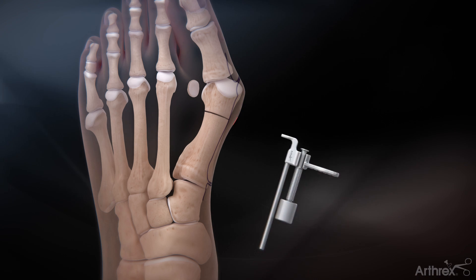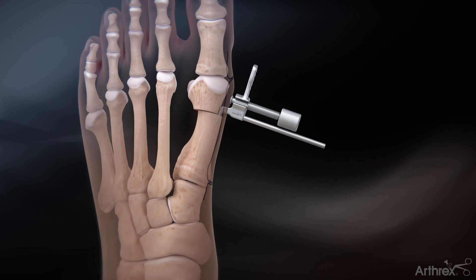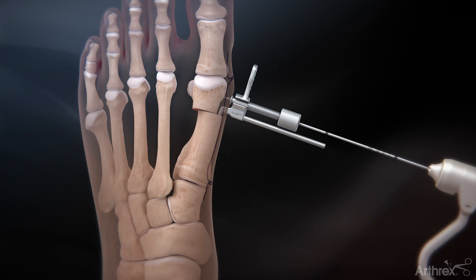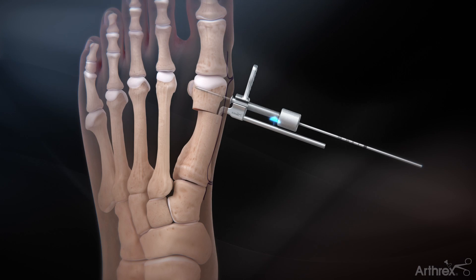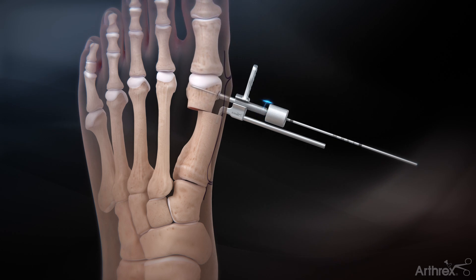Insert the shifting device by placing the hook into the intramedullary canal. Apply any rotational correction that may be needed prior to inserting the guide wire through the shifting device. Ensure that the tip of the guide wire terminates at the lateral cortex. Turn the knob on the shifting device clockwise to shift the capital fragment laterally.